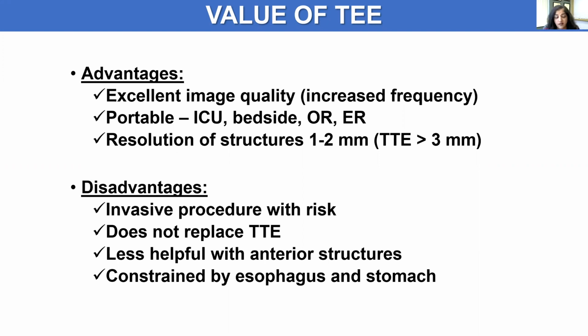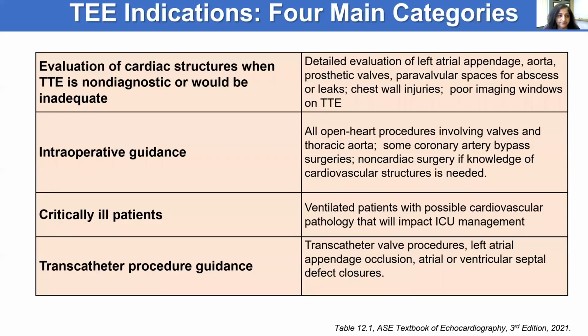The disadvantage of TEE is that it's an invasive procedure. There are risks of the TEE procedure itself as well as the sedation required. It doesn't replace TTE, it's often complementary, and it's less helpful with anterior structures. Structures that are further away from the esophagus are harder to evaluate. Finally, with TEE, you're limited by the constraints of the esophagus and the stomach, and physically what you can see from those two areas.